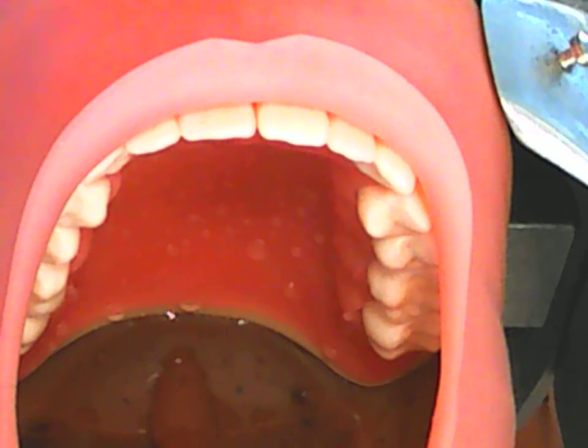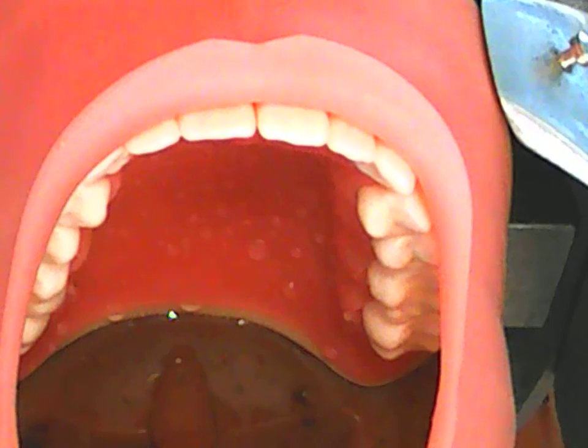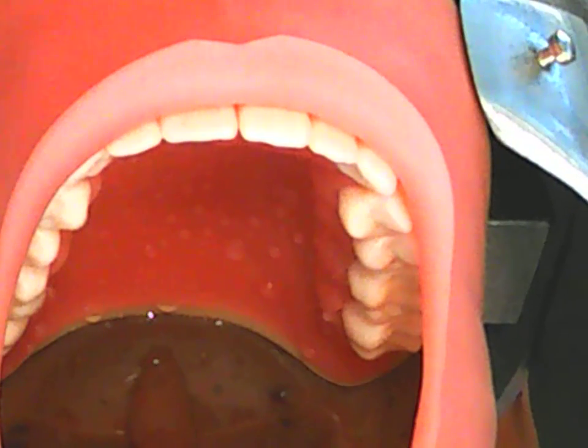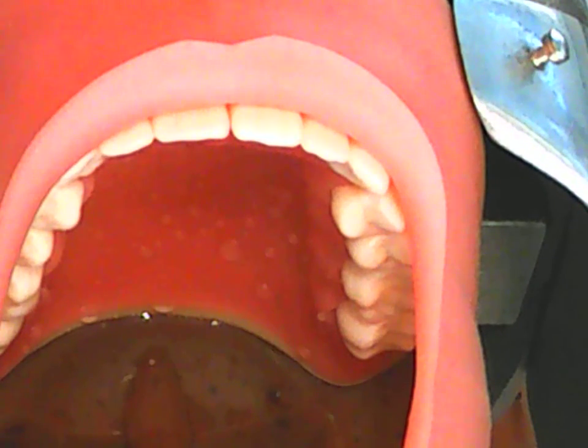So we want to proceed with punching the dental dam. This is on the maxillary arch, so your first landmark is going to be 2 centimeters from the edge of the dental dam. For a quick orientation, half a thumb length, from the end of your thumb to your first knuckle, is usually about 2 centimeters. You can also use your dental dam punch as a guide. Your first punch is basically the length of your dental dam punch from the opening to the key punch pad.